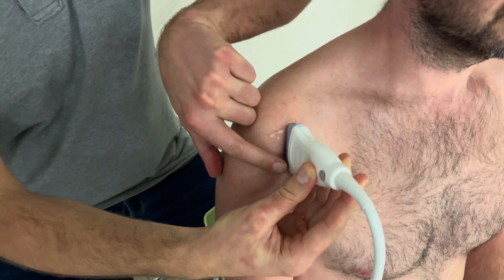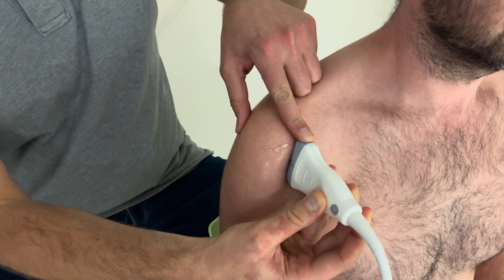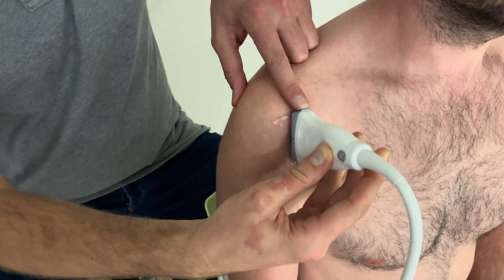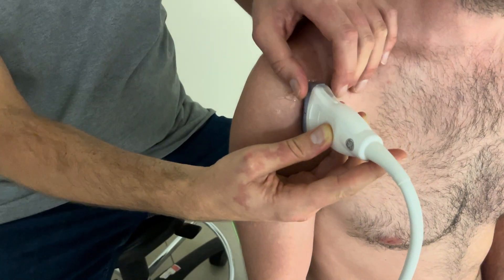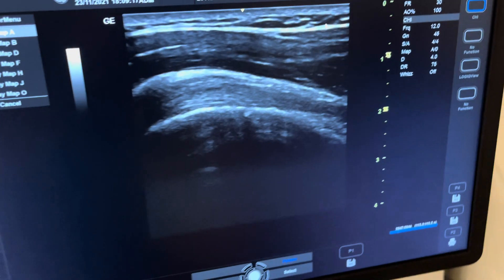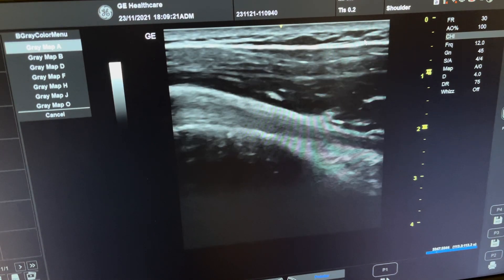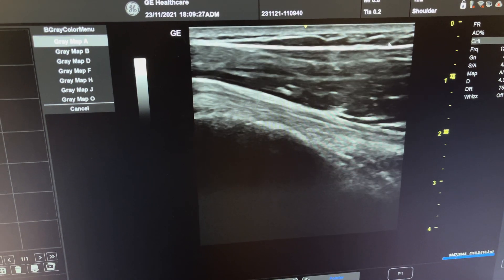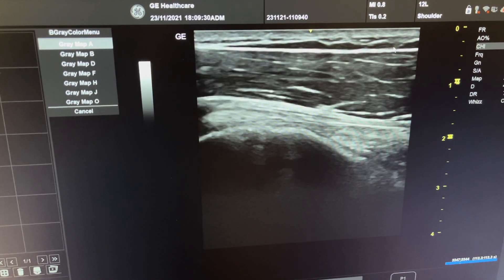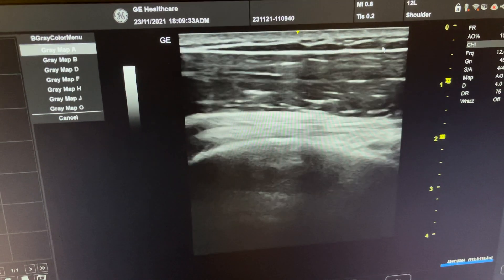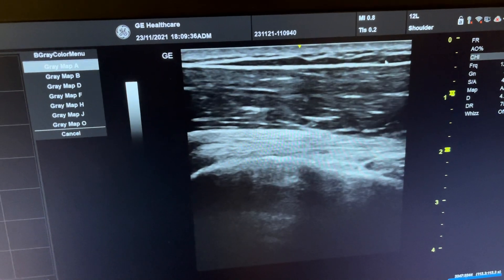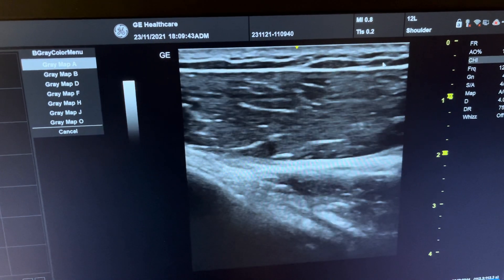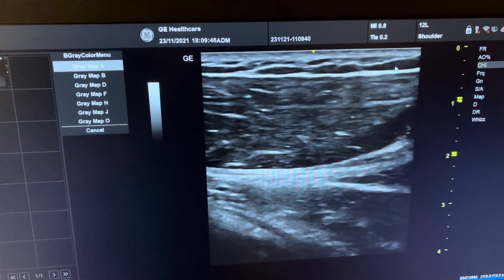To correct the anisotropy, you need the sound beams to be perpendicular to the tendon lines. From this position, take the distal tip of the probe and press it in — don't keep it perpendicular to the skin, make it perpendicular to the tendon. Push the distal tip in. On the image you can see that where the tendon appeared hypoechoic and hard to distinguish, pushing the distal tip in reveals a nice long axis view of the tendon.